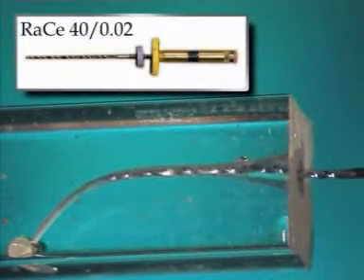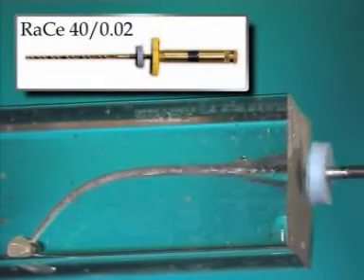And finally, 4002 to complete the apical box.